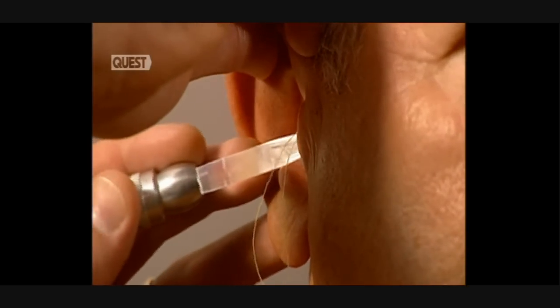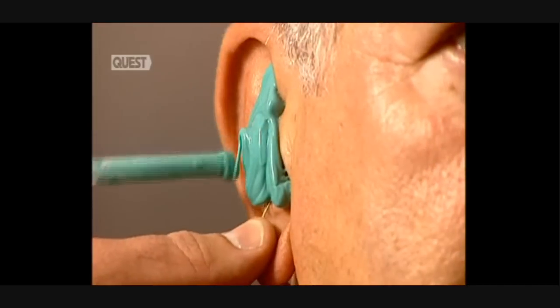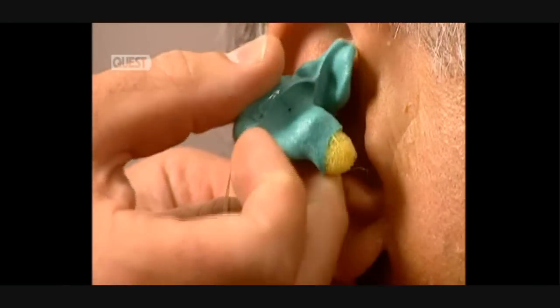Before construction begins, a hearing test is needed. An audiometer tests the patient's hearing and a report is produced. Next, a mould of the ear canal is made. A silicon liquid is administered to create an impression. Once solidified, it's carefully removed.